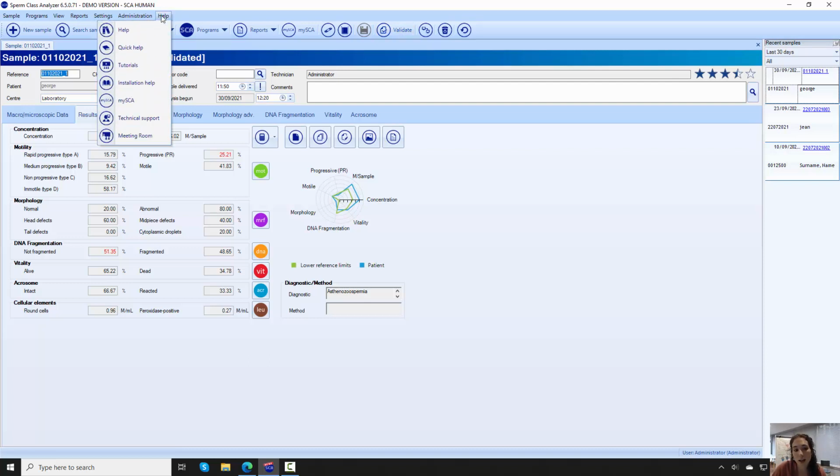Also to mention that here in Microptic we count with strong technical support during our working hours. You can just ask for remote support and we will help you by seeing your screen and taking the control of the mouse. So if there is any error message on the screen or any problem or doubt, it's possible to ask for remote support, and online in the distance we will help you, and the majority of the problems can be solved like this.